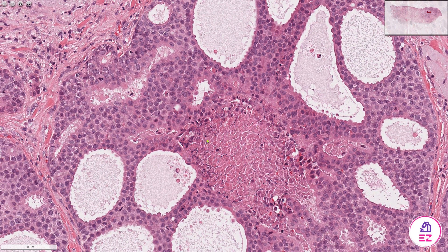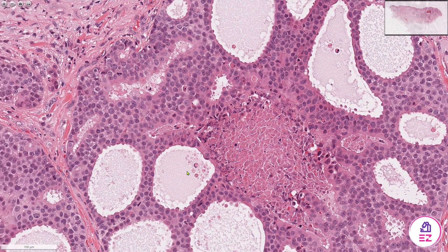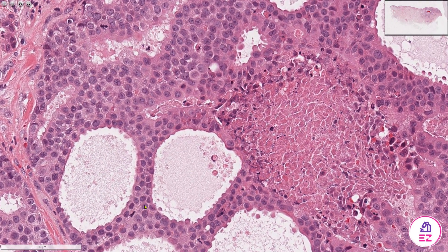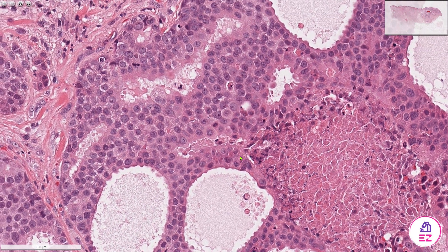If we look at these cystic spaces in more detail, there's a hint of apocrine blebbing as well, which is another feature you might see.